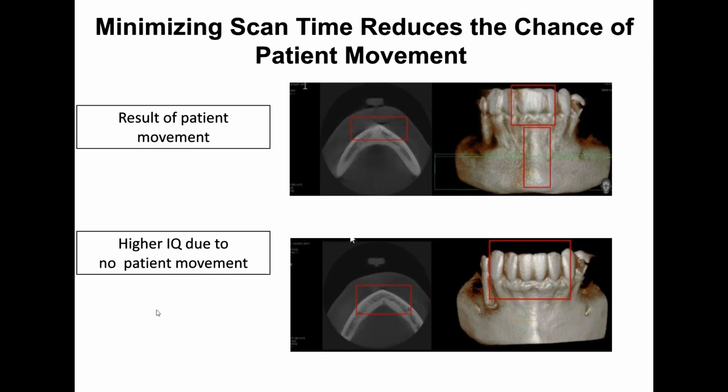Yeah, and that'll really show that higher image quality. You can see on the top here where you have that blurriness, and in the bottom where it's nice and clean and clear.